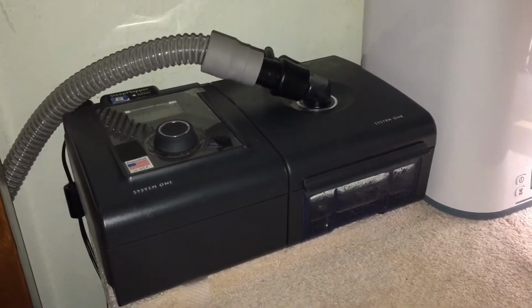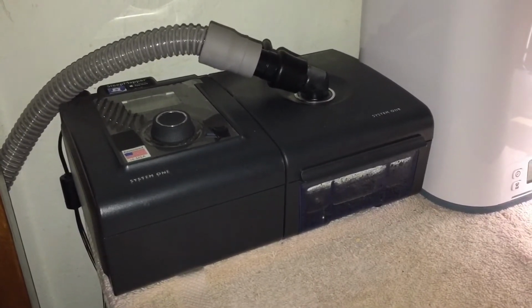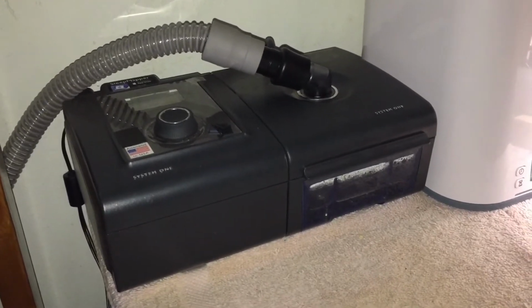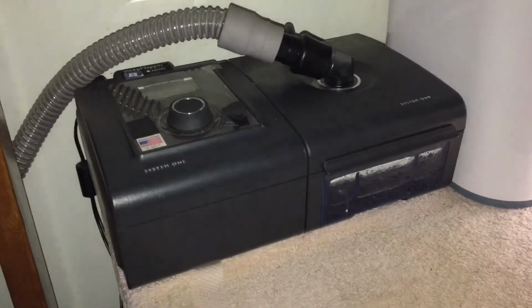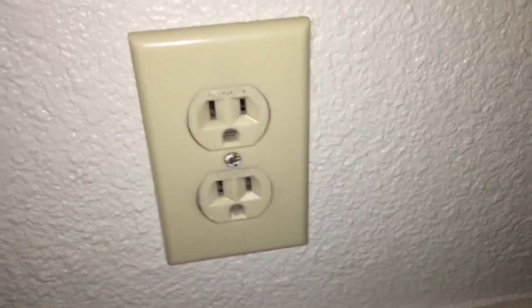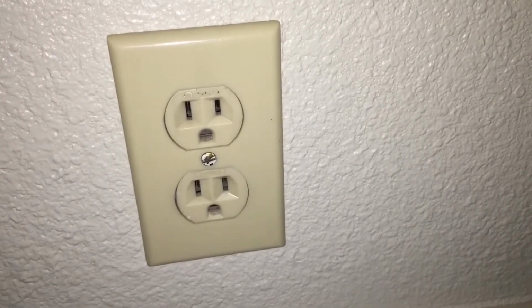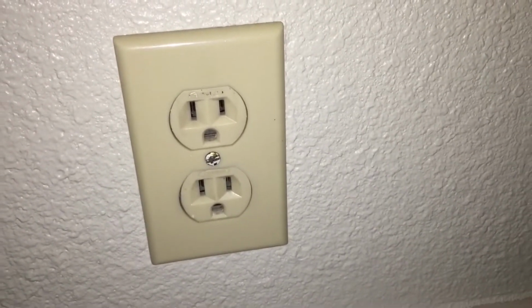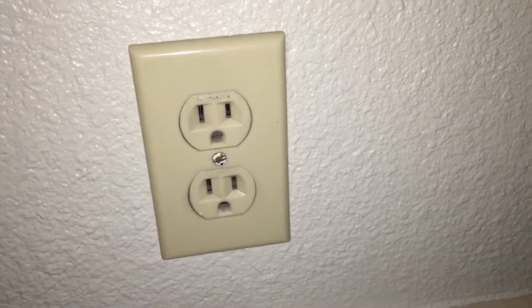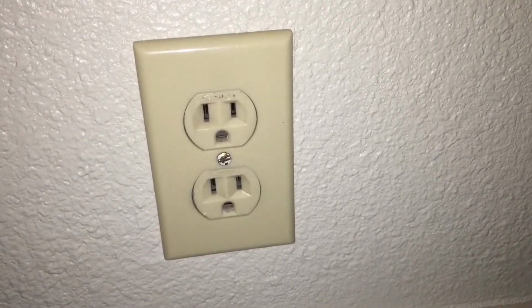To breathe or not to breathe? When you're in your camper using your CPAP machine, how do you do that? One way to do it is to plug into your 110 outlet in your camper. But what happens when you turn off your generator or unplug your camper from power, and all your power goes dead?